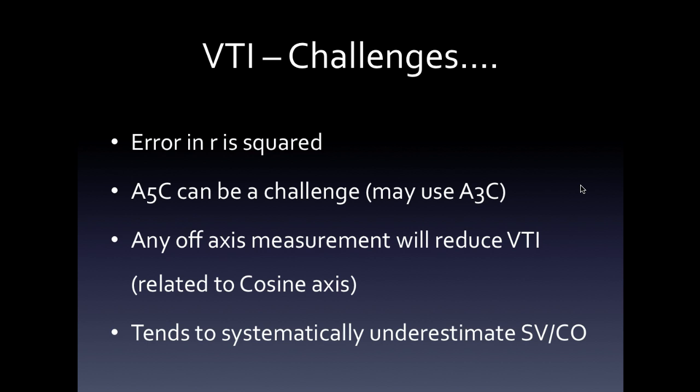And similarly, a lot of these are only ever done when you're asking a question. So I would advise people not to use this technique unless you've done it in a lot of normals. People might have their own feelings on it and use this in the room all the time, but I tend to be cautious in interpreting it.